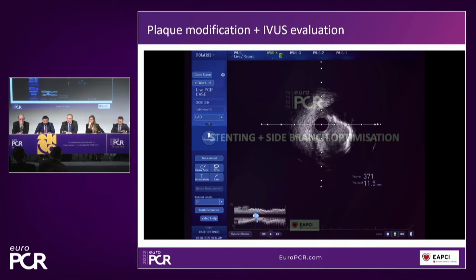That's a good point. Is there any specific setting where you would not recommend a cutting balloon? I'd like to get your thoughts about calcified nodule. Is this a good way to go, or what are your thoughts? For calcified nodules, I think we still don't have a great answer as to what the best modality is, because there are different types of calcified nodules, some of which you can actually cut and allow for expansion. In other types, the calcium nodule will just get pushed out and you really haven't done anything. So I think that's still an area of ongoing research, and it's still a pain point for all of us.